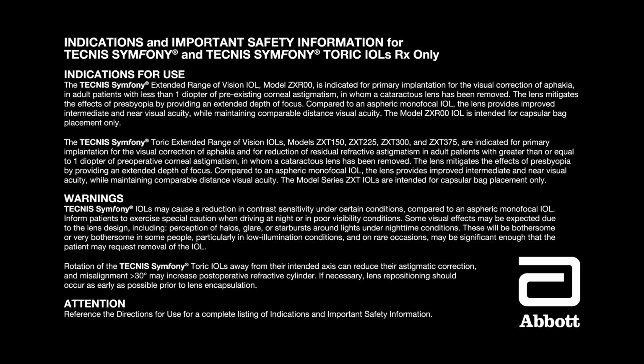Warnings: Tecnis Symfony IOLs may cause a reduction in contrast sensitivity under certain conditions compared to an aspheric monofocal IOL. Inform patients to exercise special caution when driving at night or in poor visibility conditions. Some visual effects may be expected due to the lens design, including perception of halos, glare, or starbursts around lights under nighttime conditions. These will be bothersome or very bothersome in some people, particularly in low illumination conditions, and on rare occasions may be significant enough that the patient may request removal of the IOL.